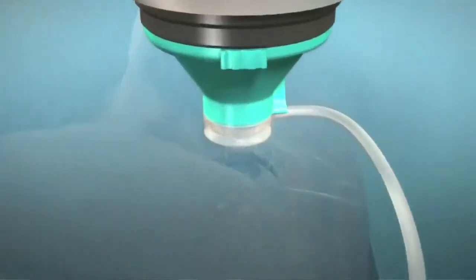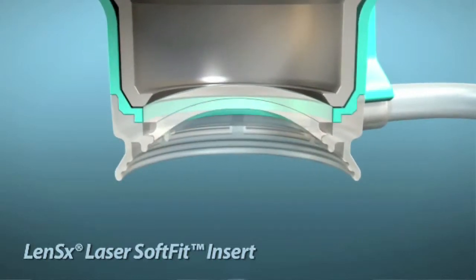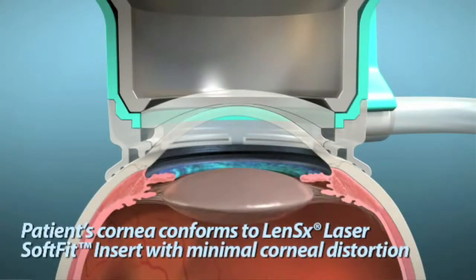I was fortunate that I only had to deal with the prior software for maybe 6 weeks, and then the soft fit was available, and so I noticed a dramatic difference in the ease of docking with the soft fit compared to the original. And part of that is just visualization. With the prior interface, you would get some fogging, and so it would be hard to center because the visualization just wasn't as good. But with the soft fit, the visualization has been very good throughout the entire process. So if you can see what you're doing, you can much better center, and that's been the case for sure.